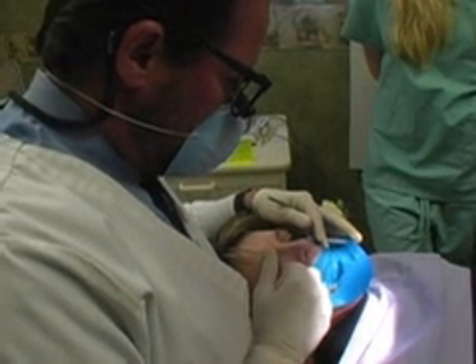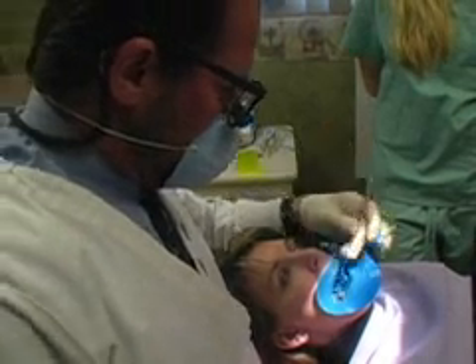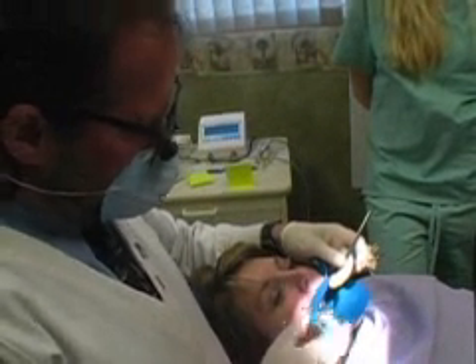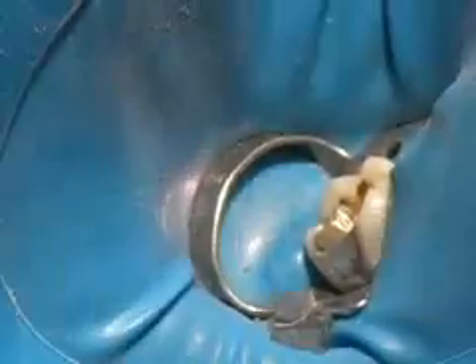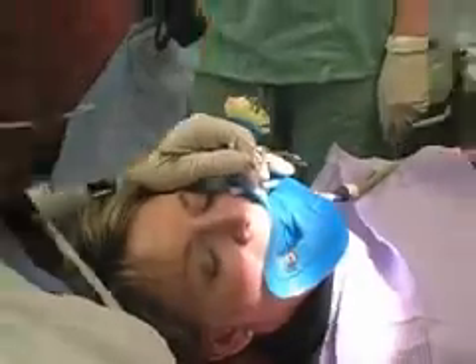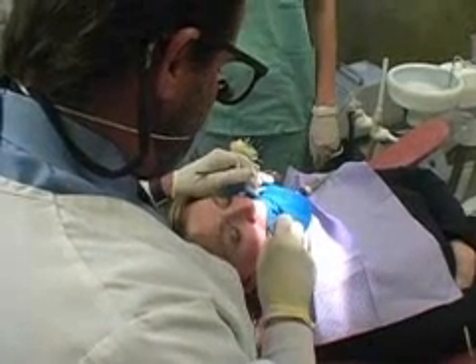Sheila is doing fine — she's not having any problems, probably watching the TV. Here we're cleaning everything out, making sure there's no more infected tissue in the tooth. After the tooth is shaped, we let the sodium hypochlorite sit inside the canal — we'll irrigate it and let that sit in there for about five to ten minutes. That allows the tooth to disinfect even further before we fill it, and it gives the patient a break as well, letting all the bacteria and tissue dissolve inside the root.